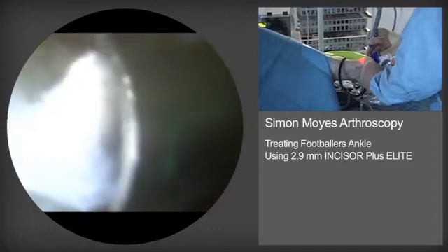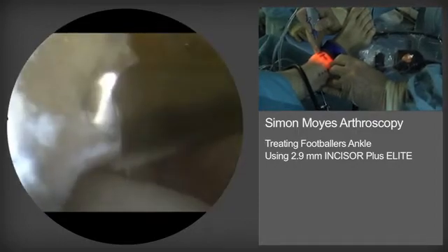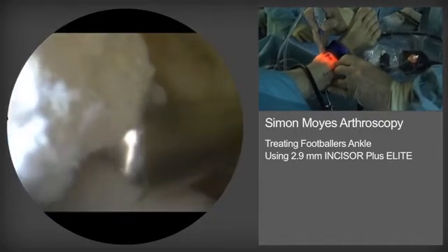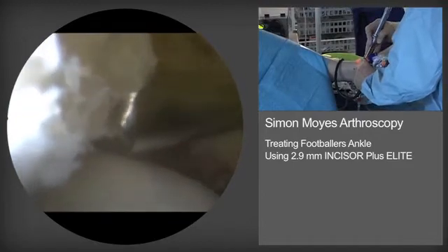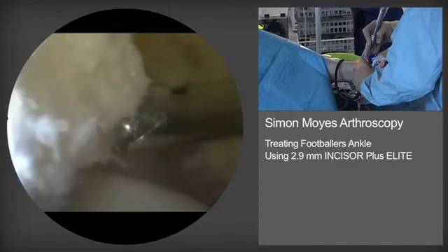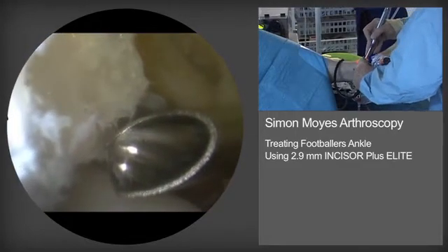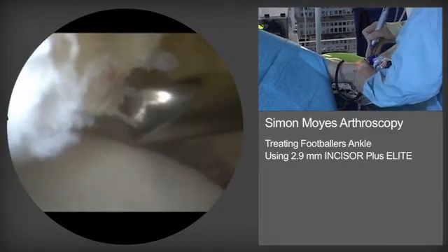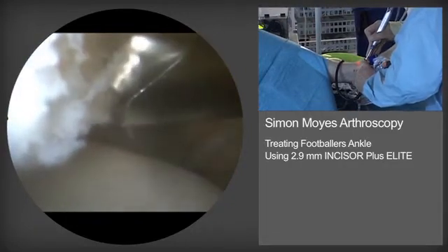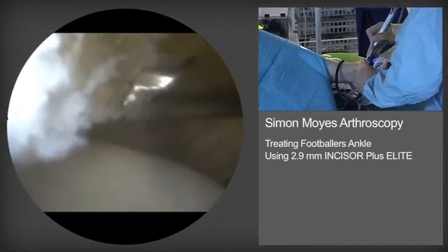We are using the camera to view horizontally across the distal tibial spur, removing the burr lateral to medial and inferior to superior, removing the tibial spur and restoring a normal tibial-talar angle. This is a nice oval burr which eventually produces a nice flat surface to the distal tibia.